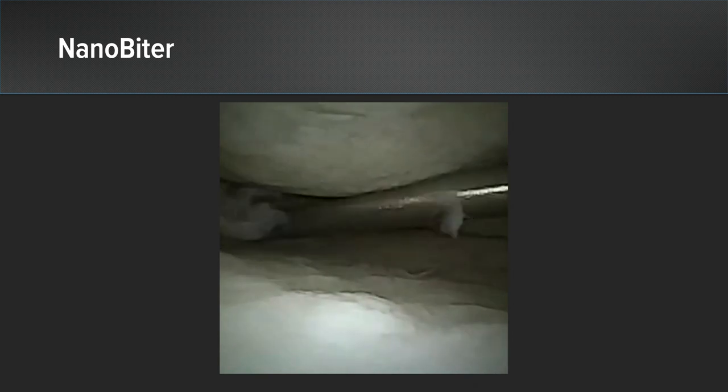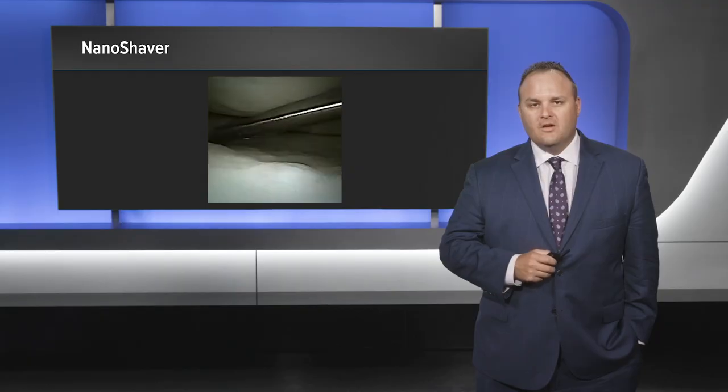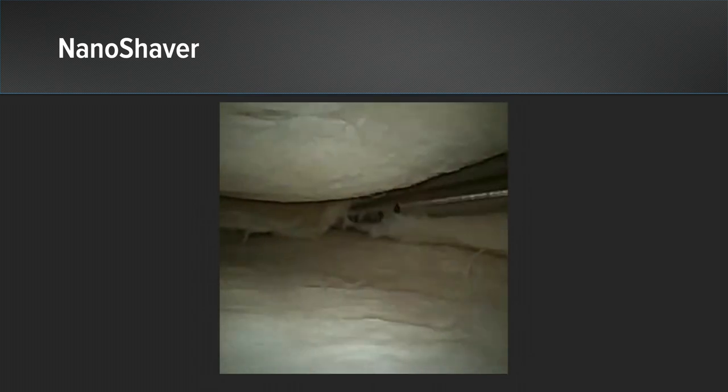You can see how easily the NanoBiter gets under the medial femoral condyle and can reach the posterior joint space. Here you can see we finish up the partial medial meniscectomy using the NanoShaver. You can see how easily it gets around the femoral condyle and performs a partial medial meniscectomy.